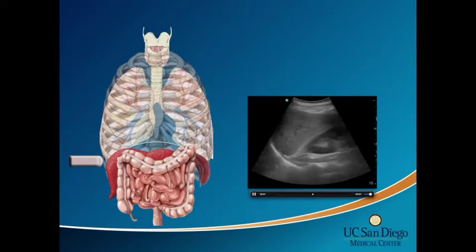That's the spine there. And so this is normal because you can see the spine going, that's your thoracic spine, and suddenly the spine just kind of ends. Let me pause the video for a second. So the spine just kind of ends, right? And you know that the patient still has the thoracic and cervical spine, and the reason why it ends is because above the diaphragm, there's all lung. And remember, lung is all artifacts, so you can't really see lung.